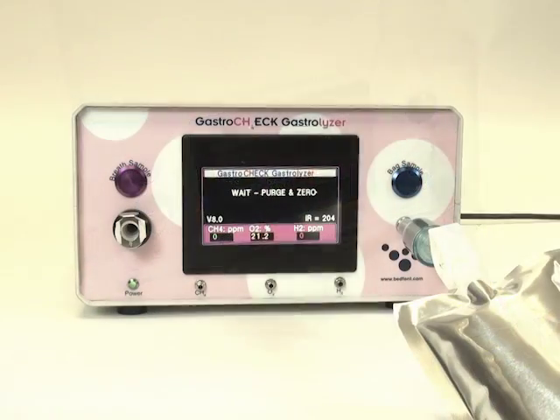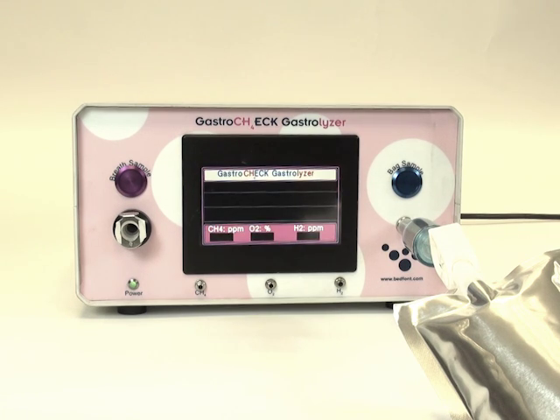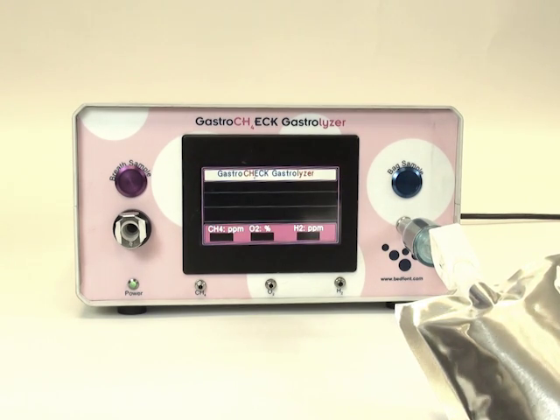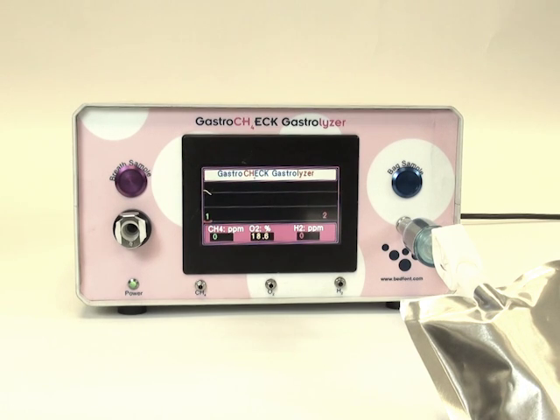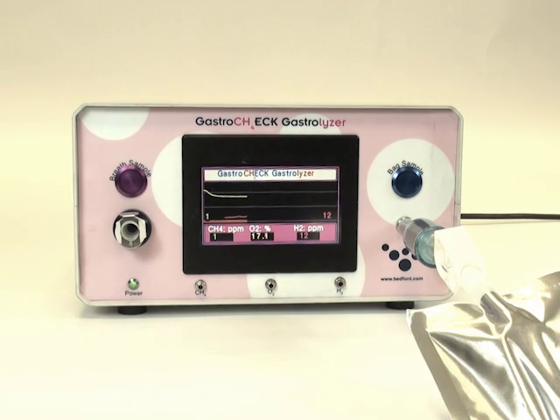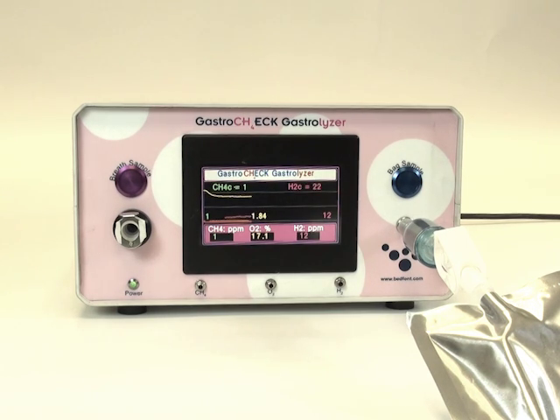The test will begin after approximately 60 seconds of zeroing. The monitor's internal pump will draw the sample from the breath bag. After 45 seconds, the test will complete and the results will be displayed on the screen. After the results have been recorded, you can press the breath test button to go into standby mode, ready for the next test.